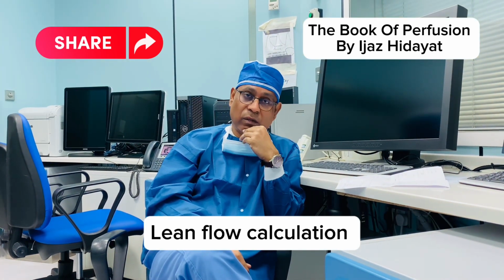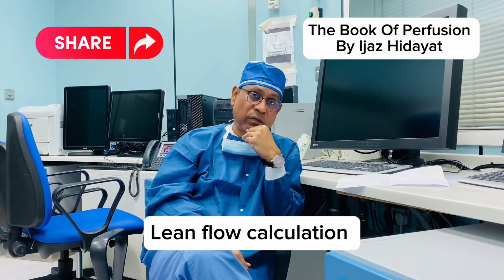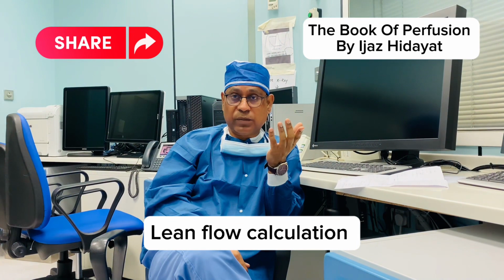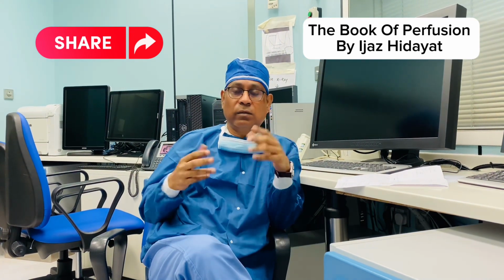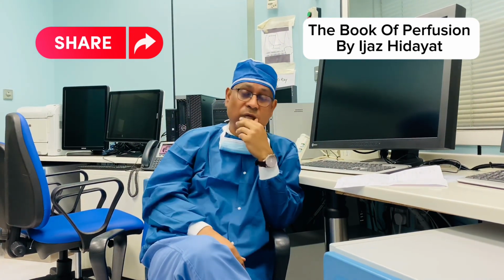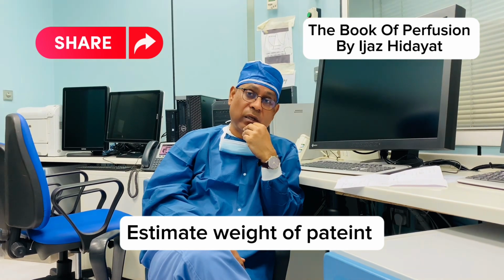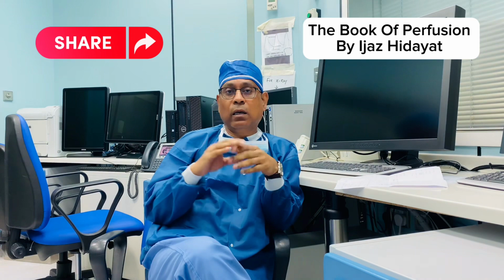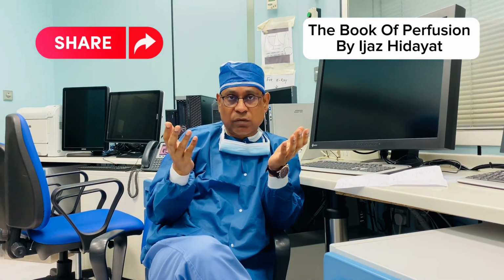We need to find out the body surface area and the calculated blood flow, and as we know, the obese patient has extra fat, so the intravascular volume is less. So first of all, we need to calculate the estimated weight of a patient weighing 125 kilograms.